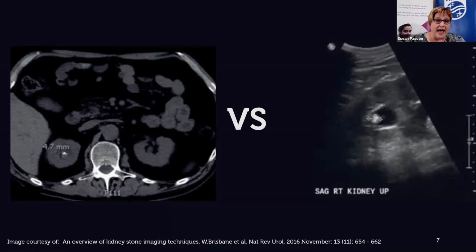In addition to all that, when we're ultrasounding, if those stones are stuck in the ureter, it can present a challenge for finding them because there's overlying bowel gas and increased depth of penetration to get to our target. And so it can increase the complexity of actually being able to see them. It's only once it actually causes an obstruction that helps us highlight where they are. And even then, with that overlying bowel gas, it can be really quite tricky.